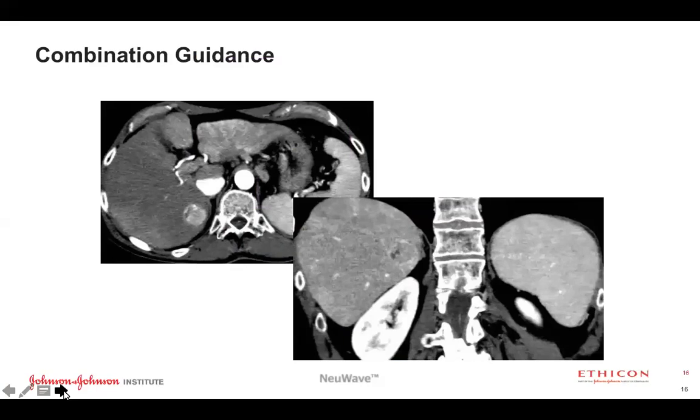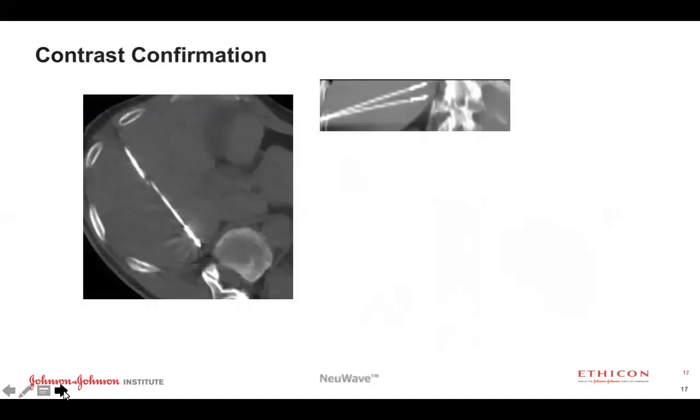And then a combination of all, and I kind of alluded to that. I really like to use a combination of ultrasound and CT guidance for optimal positioning of the probes. So here's an example of a lesion in segment 7 of the liver, hyperenhancing, and that's the delayed phase with a pseudocapsule around it. This is hepatocellular carcinoma.